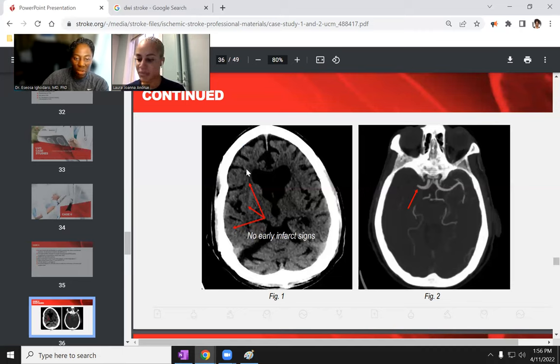So the big things that you're going to be wanting to look for on a CT head is there bleed, no bleed. And like we said, bone is hyperdense, air is hypodense. So if I see a white area inside the brain, then I'm like, okay, is that normal or is that not normal? I don't want to get too advanced. There's certain regions in the brain that are hyperdense, like the pineal gland and the choroid plexus, but you'll typically see that in the ventricles. Big picture, hyperdense in the brain more likely means blood. And that's pretty much all you're looking for on CT.